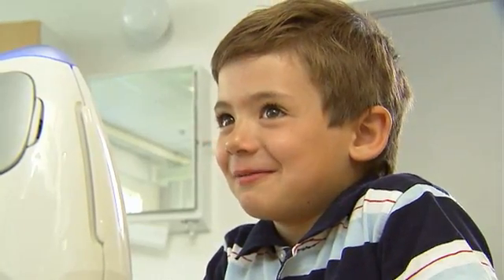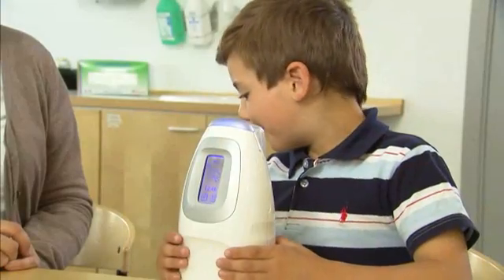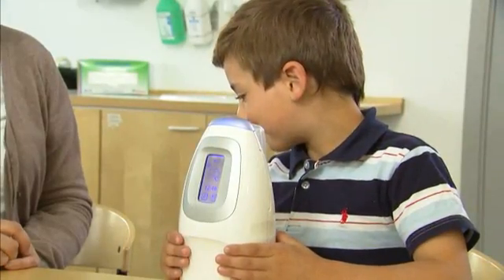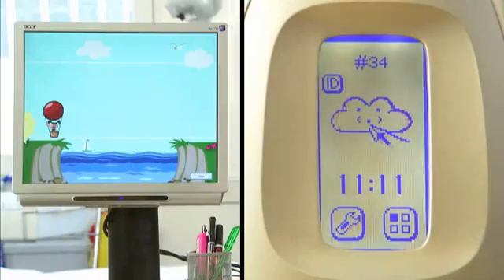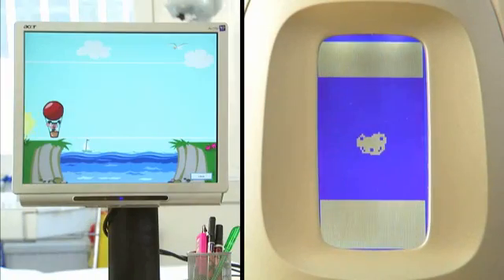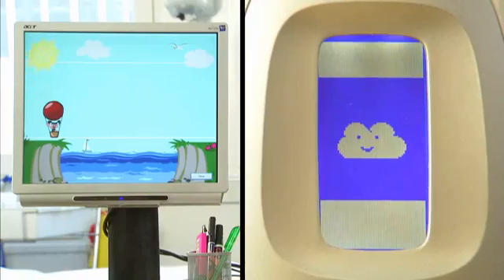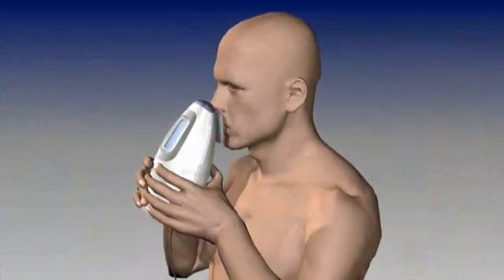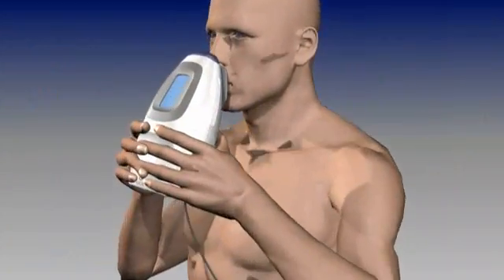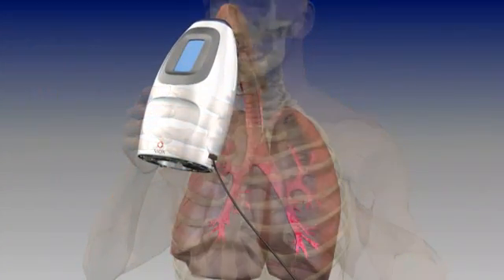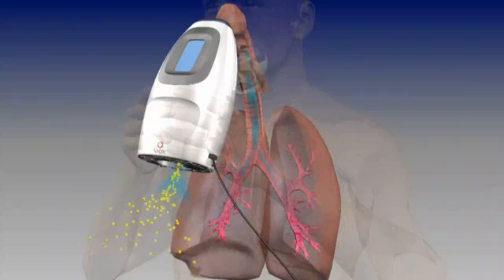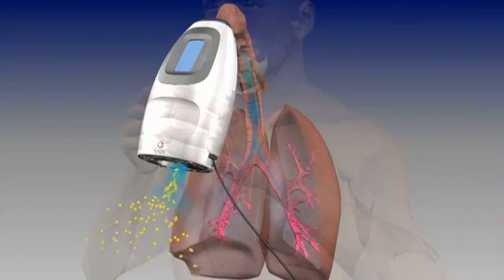total lung capacity. This process effectively cleans the air from ambient nitric oxide that could otherwise interfere with measurement results.